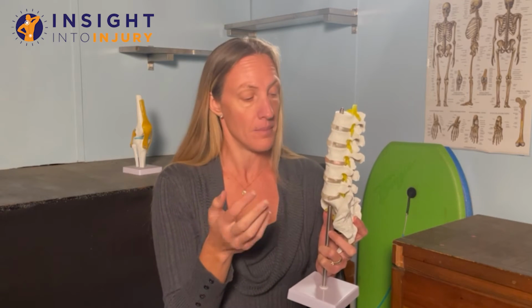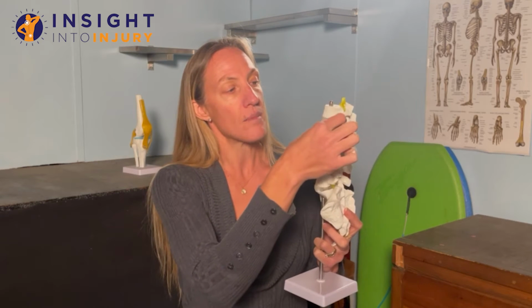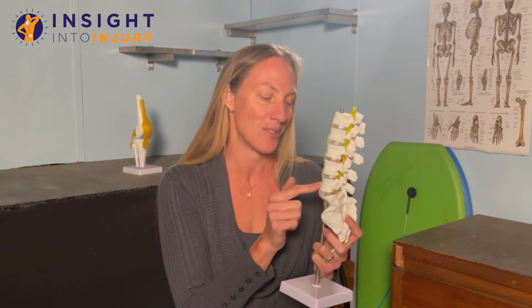Or your L5S1, so the S stands for the sacrum, and the disc that's in between those. They can identify which level is giving you your problem, or which levels perhaps, and that also correlates with the nerves that come out. So the nerve that comes out way up here at L1 goes more down to your quad or the front of your thigh, whereas down there in L5, that's kind of the one that goes way down towards your big toe. So we can kind of tell, oh yeah, that explains why you're having pain in that area. It's because you've got a disc problem at that spinal level.